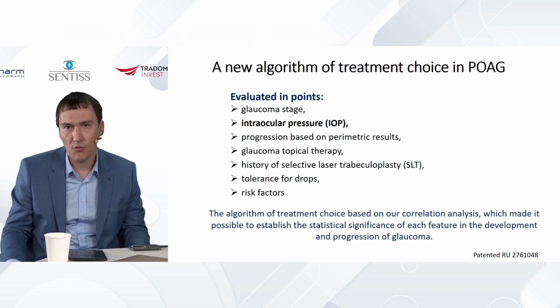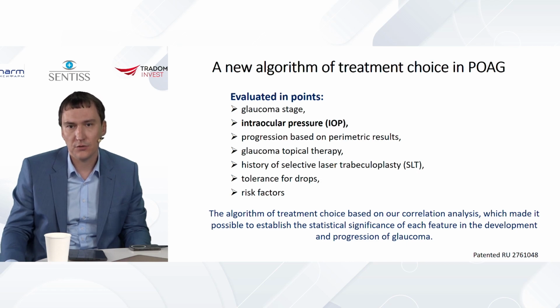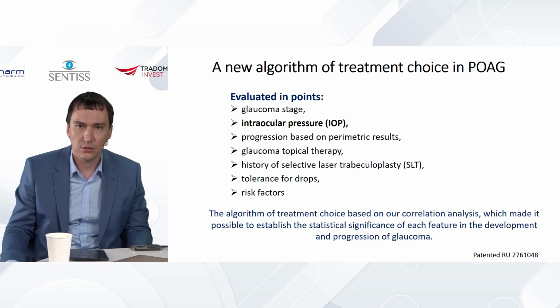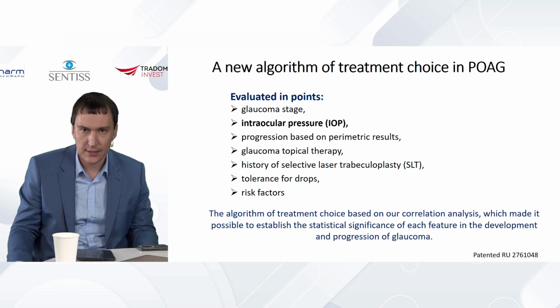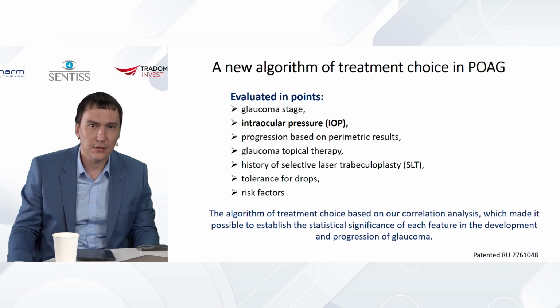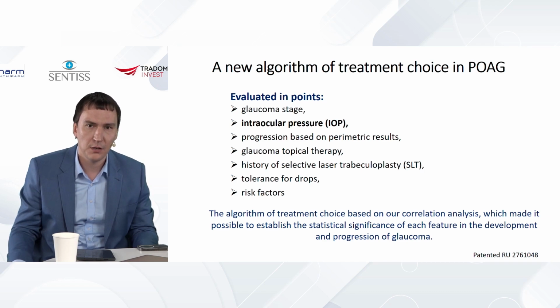And last but not least, making tactical decisions in glaucoma and creation of particular algorithms. So in this context, we have some publications as well. If someone uses AI, then first we need to get into the depth of the problem, to see particular reasons and causes, and later on we will train the machine by that. And I think very important here is the search of particular algorithms of results analysis.